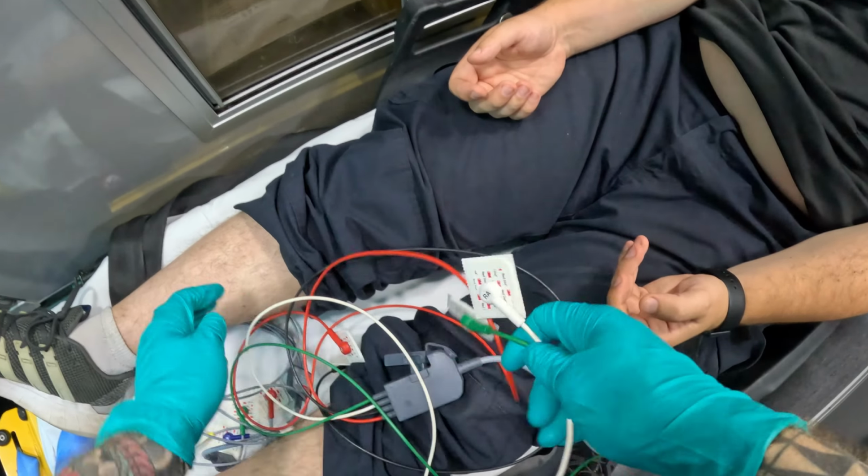All right, so now remain still. We're going to click 12 lead again, and at the bottom it says acquiring 12 lead. So please don't move. Remain comfortable, just breathe normally. Once it acquires the 12 lead, it will automatically print it for you. You don't have to press any additional buttons, and you don't have to click print again to stop. It will just print it out normally.